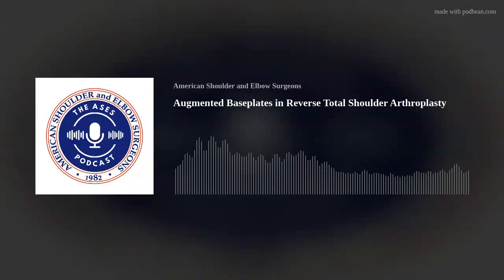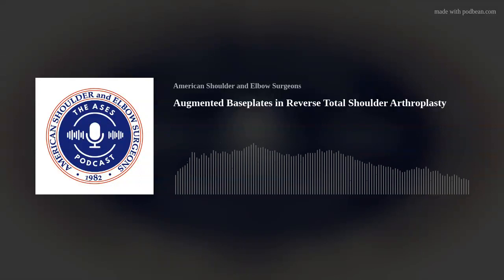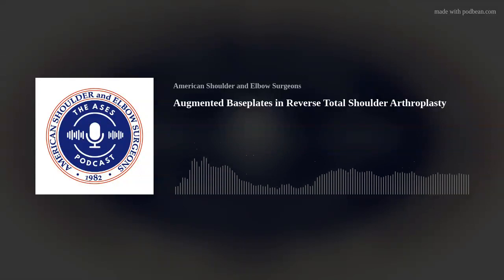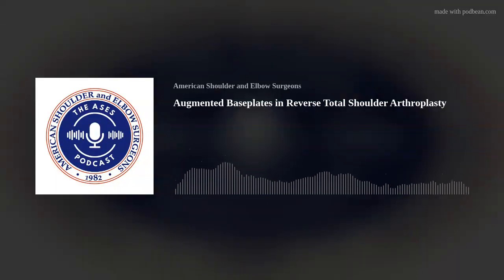So Chris, you talked a little bit about how you worry more if you see the keel, if there's a prior glenoid component. Let's talk about that scenario. So often, if there's a prior base plate and it's been taken out for infection, or if there's a prior loose anatomic glenoid component, how are you addressing the patient with a more cavitary defect, or maybe an uncontained defect in that revision glenoid? Is that still an augment for you, or is that a situation where you're more tending towards bone graft or custom component? How do you approach that, Chris?